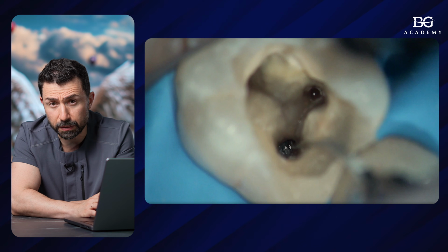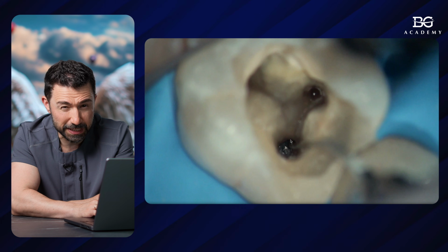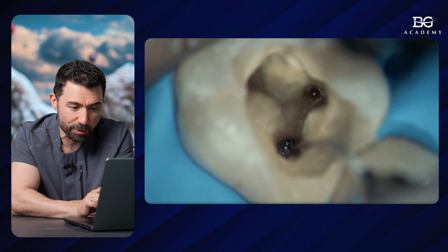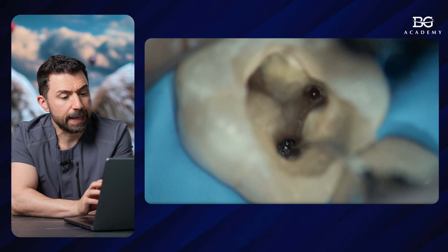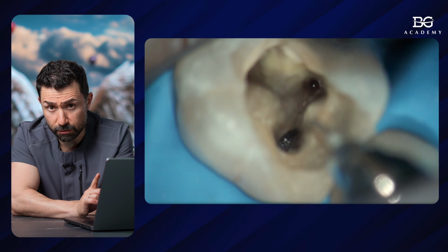The instrument was broken in a mesiobuccal canal, so the file is bent distally and lingually, and it follows the isthmus, because you can see the isthmus, this line approaching the deeper portions of the root, and we are able to instrument that. So using this ultrasound, we are shaving the dentin in a safe direction.